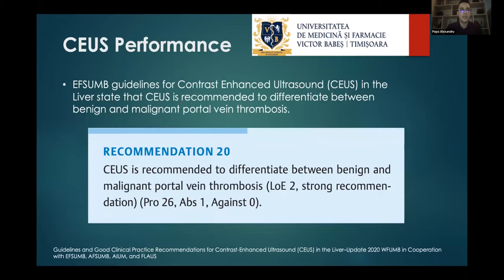Also, the latest EFSUMB guideline, published in 2020, states that CEUS is recommended to differentiate between benign and malignant portal vein thrombosis.